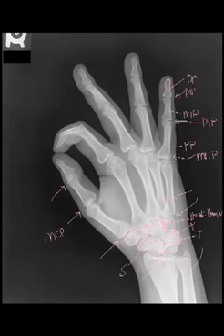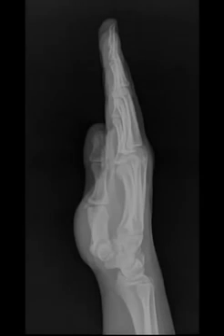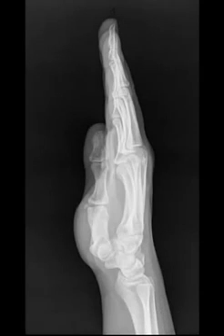Now we will move on to the lateral projection. We are now looking at the lateral projection. Let's start again with the bones of the wrist. Ulna, ulnar styloid, radius, radial styloid, lunate. Here is where we see the very nice lunar shape of the lunate. Now the lunate is going to stand out for you. It's going to be the first bone you see that's semilunar in shape, sitting directly on top of the radius.